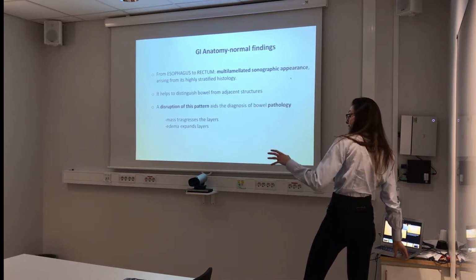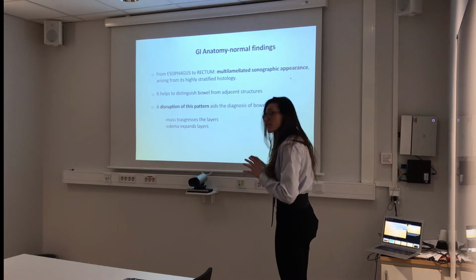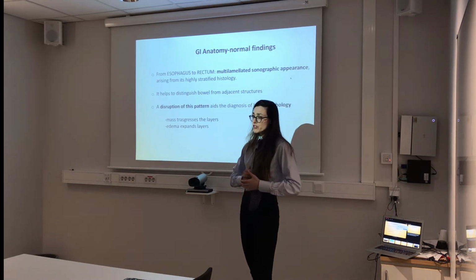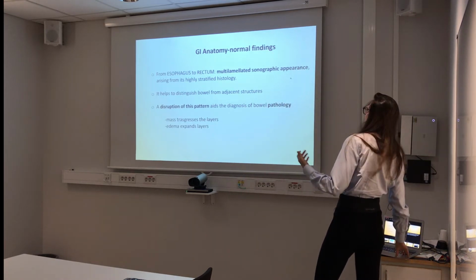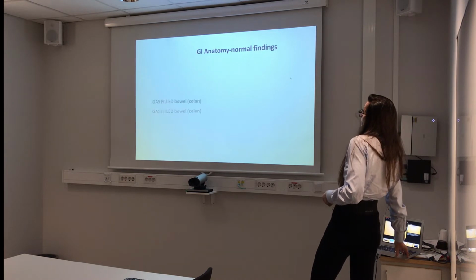So once again, small bowel, you can see it. Colon, you cannot see it. You just see air. Sometimes when you do the FAST, it's very difficult because there is a lot of air. This is a flexure of the colon, the ascending colon. So it's not pathological. It's just what it is, because the patient has eaten, for example, 1 hour before the trauma, before coming in.